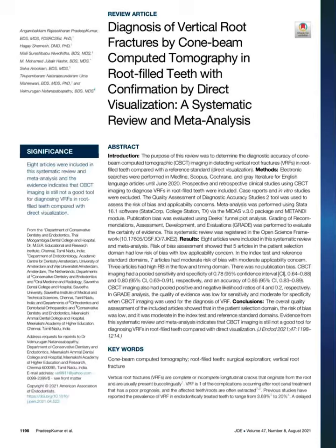The purpose of the study was to determine the diagnostic accuracy of CBCT imaging in detecting vertical root fractures in root-filled teeth. The findings were compared against a reference standard, which was direct visualization. The diagnosis of vertical root fracture is difficult in most clinical situations, and it is usually identified by a combination of clinical and radiographic findings.